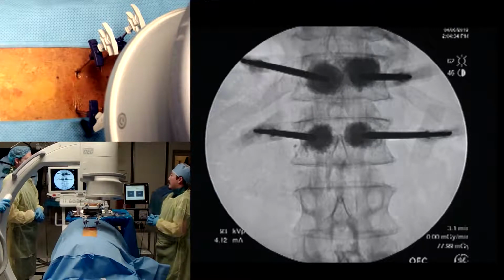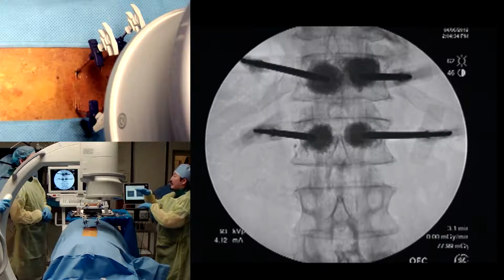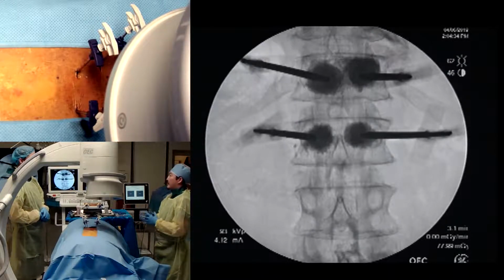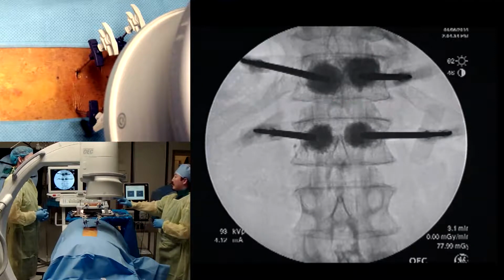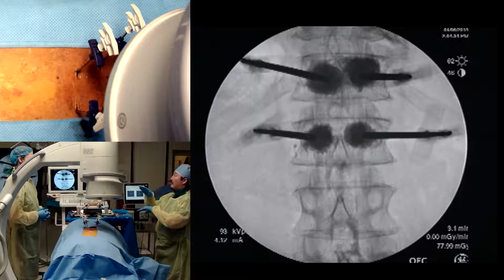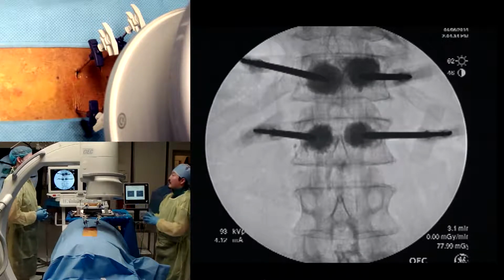Right. Whereas in a vertebral compression fracture, you want to try to be able to reduce the fractures as much as you possibly can. In general, I probably err towards doing more kyphoplasties rather than vertebroplasties, but it sort of depends on what you're trying to accomplish, you know? So I think having something like this makes a lot of sense to do the RF probe on the tumor itself. And then once you do that, probably just do a vertebroplasty, just to sort of maintain. But if there's tumor associated with some vertebral body collapse, then it probably makes sense to use the balloon to try to tamp it up just a little bit, prior to placement of the cement.